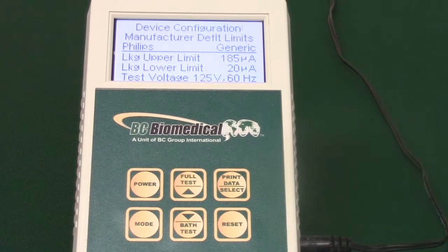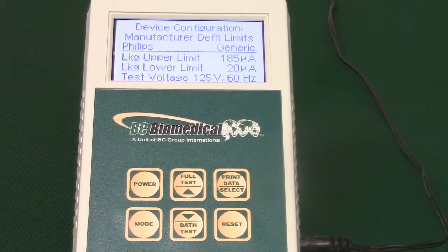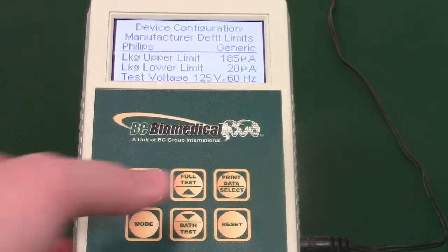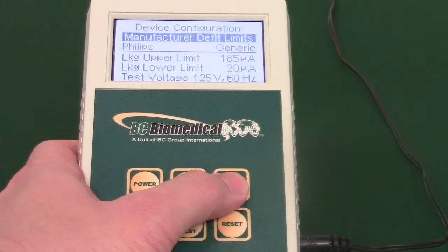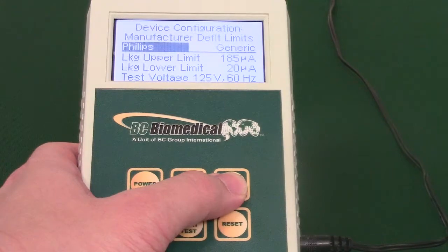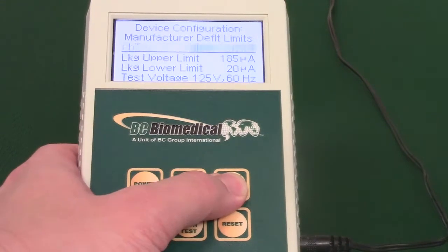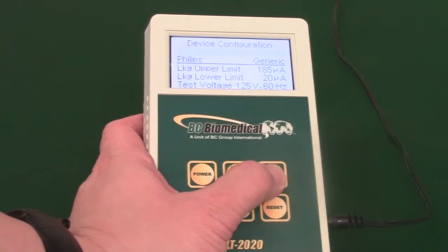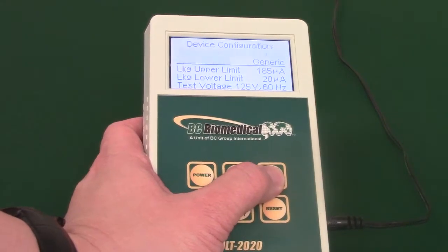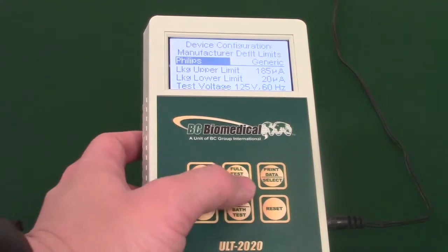Press the select key to highlight your option. For example, users can select the limit settings, manufacturer, or the probe type. Use the arrow keys to adjust highlighted areas.